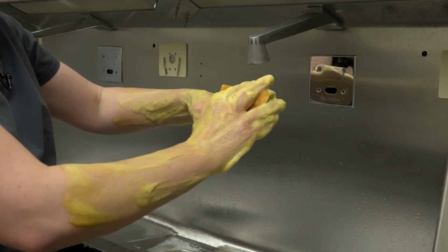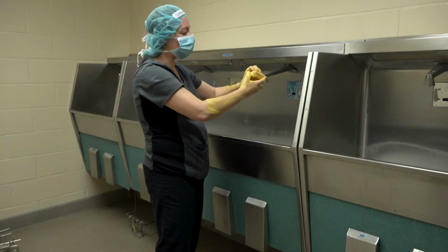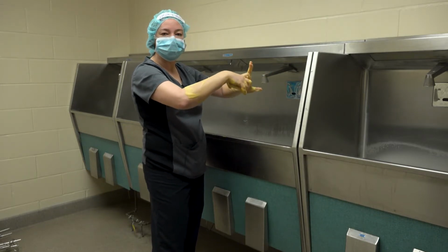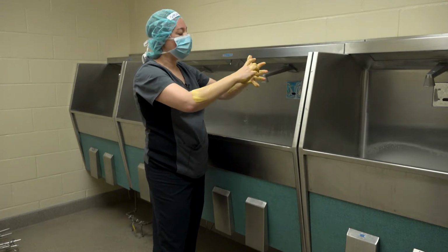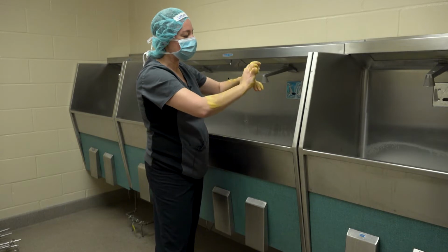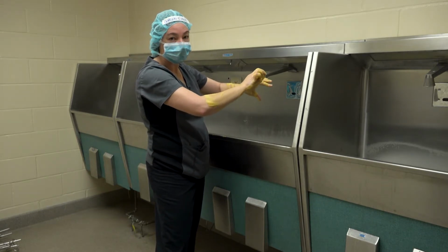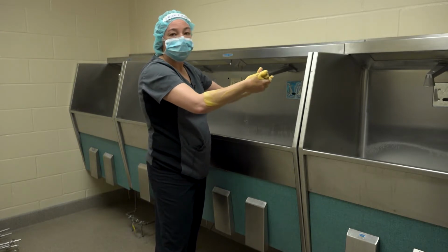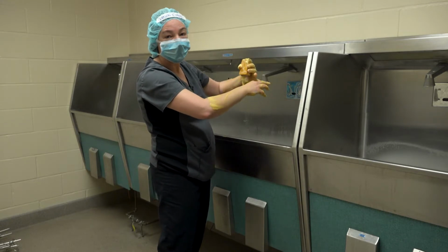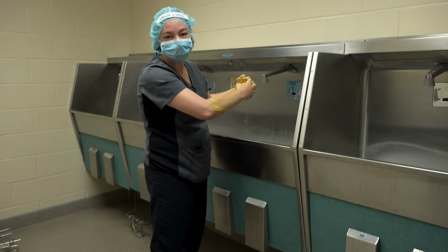Contact time has started. If you don't have a nice clock to show you how long you've been scrubbing, all you have to do is count 10 times on each surface of your hand, and arms. So then you do 1, 2, 3, 4, 5, 6, 7, 8, 9, 10, and then turn. You can do that for both hands, both arms, every surface of your finger, which will end up being 5 minutes, or you can just watch the clock like I do.